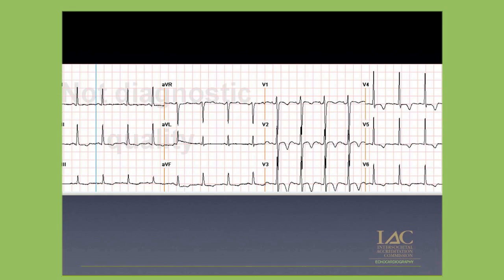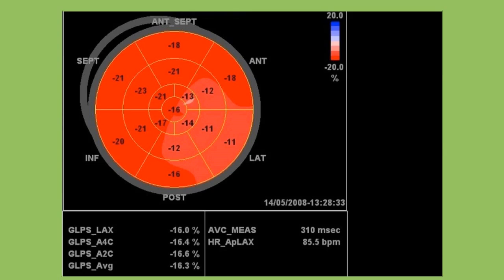And if we had not done the strain imaging, just like I have shown this case all over the globe, they would have allowed this very sick heart to receive chemotherapy. I can assure you that probably this patient would not have tolerated it. This is the way that it looked when we did the bullseye.